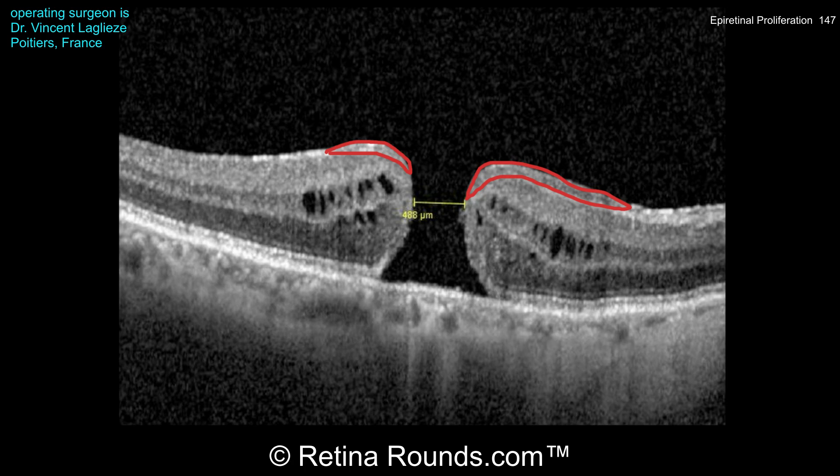This tissue is unlike an ERM in that it is continuous with the underlying ILM, does not appear to be exerting traction in the form of striae, and appears to extend especially on the nasal aspect of the hole towards the inner layers of the retina. Let's see what Dr. Leglaise does with this tissue during peeling.